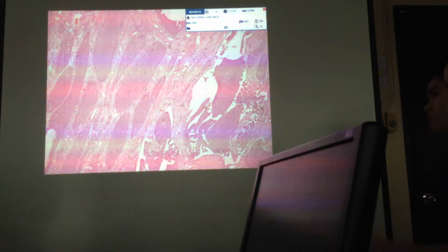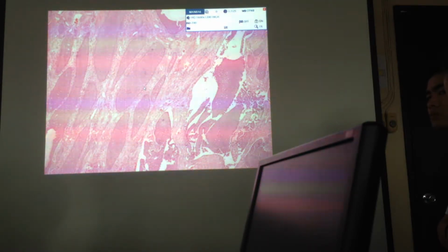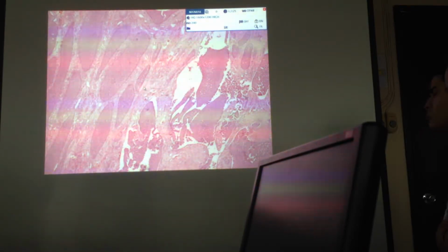Granulosa cell tumors are functional tumors. Patients with granulosa cell tumor can have hyperplasia of the endometrium. So magkakaroon siya ng simple or complex hyperplasia or even carcinoma, yung endometrial type. And sa breast naman, they can have fibrocystic change. Okay? So, granulosa cell tumor is associated with epithelial cell proliferation in the endometrium and in the breast. Okay, so paano niyo malaman kung granulosa cell tumor? Here you would see the presence of nests.